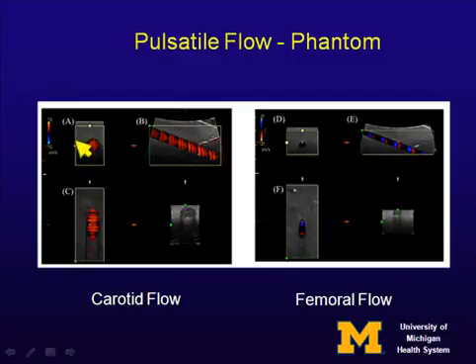By sweeping along the transverse plane, you get this image, which is now a series of high velocity, low velocity, and no velocity positions throughout the tube. The reason that's happening is the pump is pulsatile, but the sweep is slower than the pump rate.